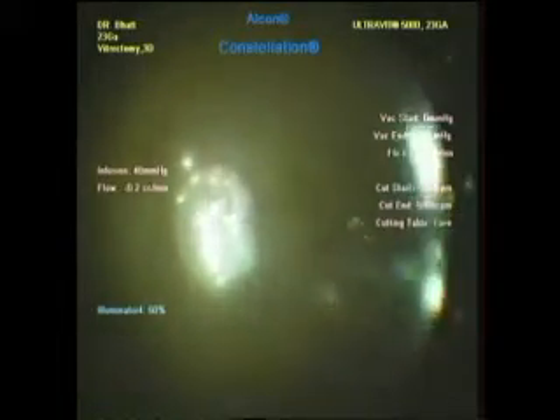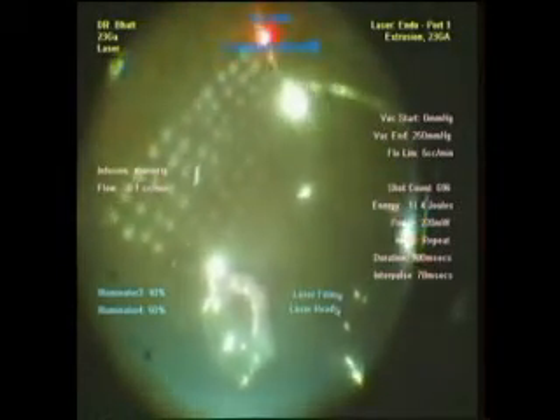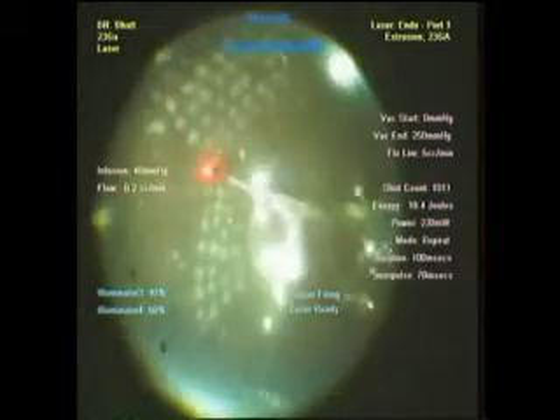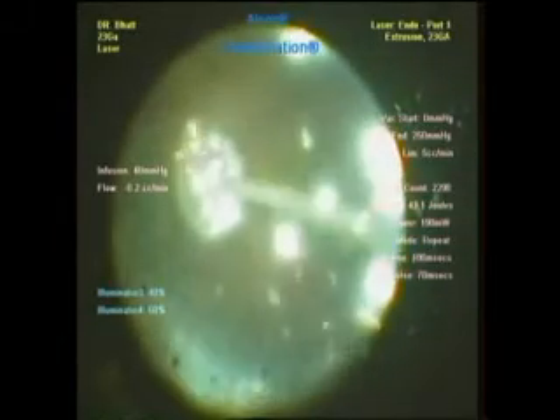After that the residual fluid is removed. We can see panretinal photocoagulation is started while the disc oozing has already stopped. We do laser photocoagulation in all uncovered areas, followed by residual fluid removal and injection of silicone oil. This is at the end of the surgery.